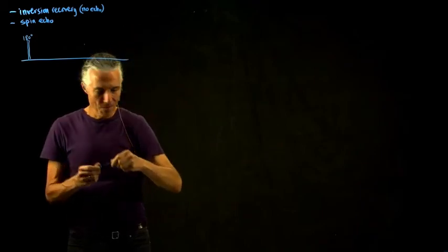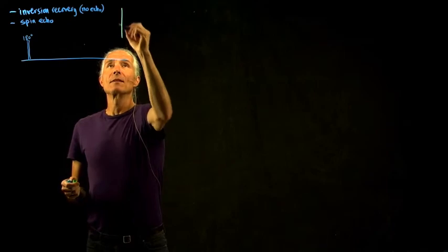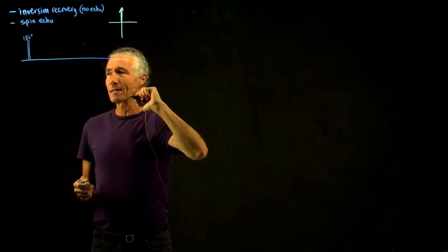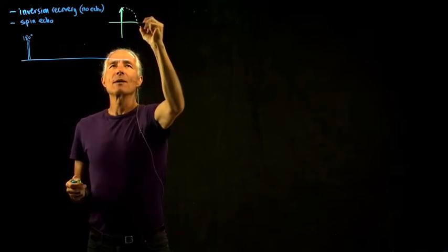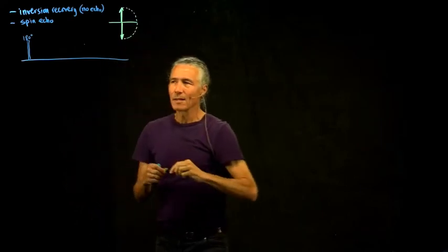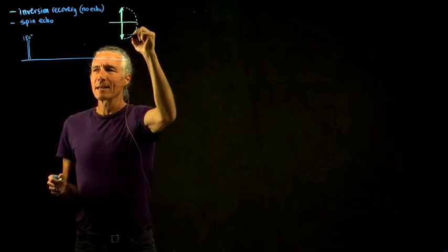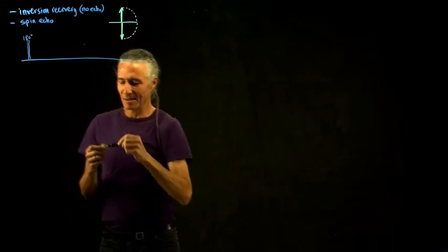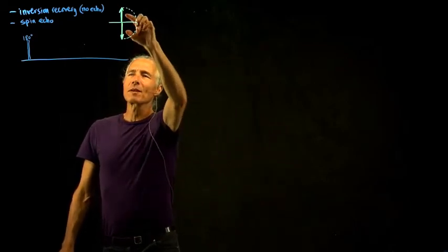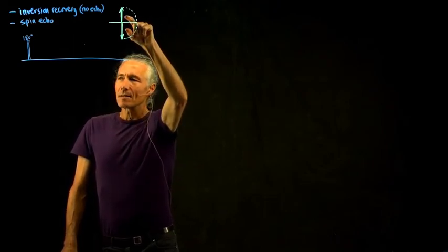Well, that means you start off with your initial magnetization, and if you do a 180 pulse, you make the longitudinal magnetization negative. That's a little counterintuitive, like how could you make it negative? But what you can think of is you're just injecting energy into the system.